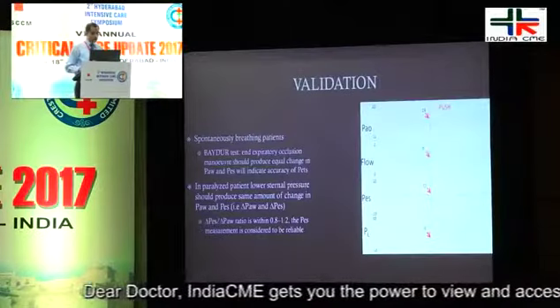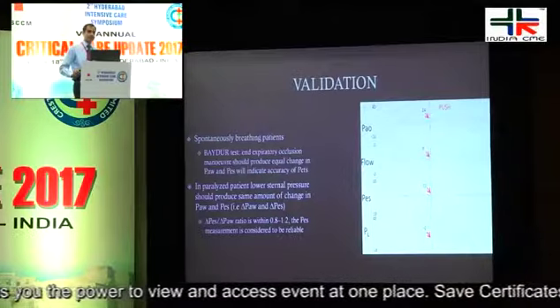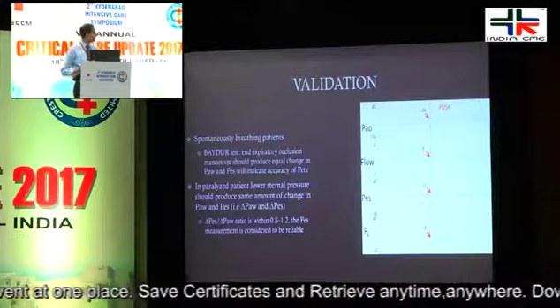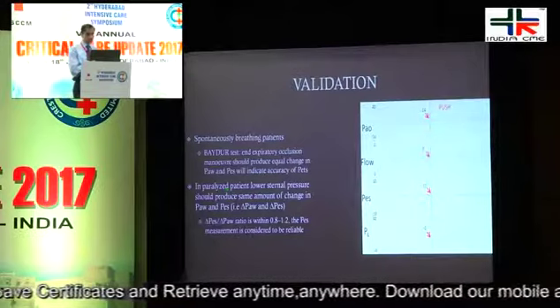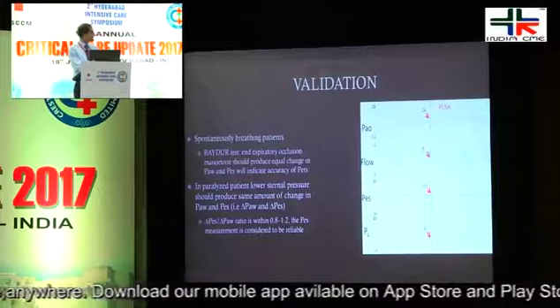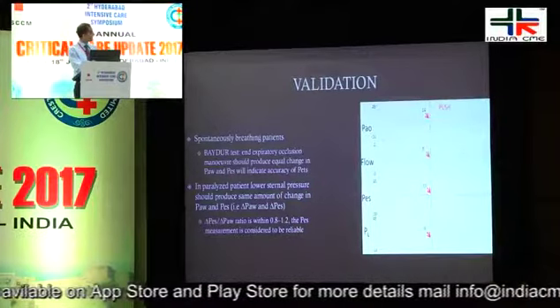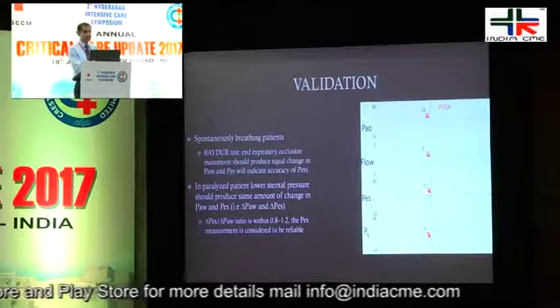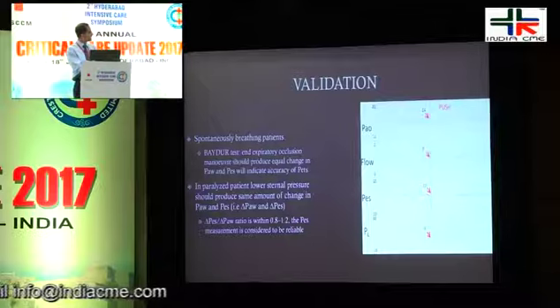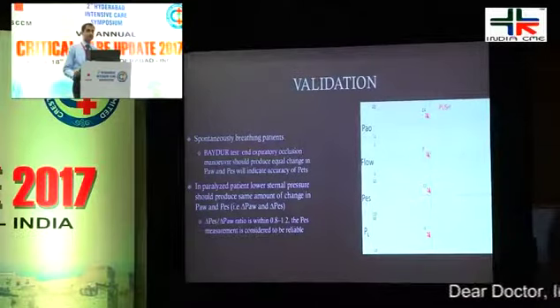Right. So, as I already told you, validation of the positioning of the tube, or the esophageal pressure system, is by what is called the Baydur test, which is nothing but you do the expiratory occlusion and you find that the deviation which happens in the airway pressure will be mimicked by the esophageal pressure. So if you get this kind of a graph when you have the end expiratory hold, then you know that you are probably optimally placed in terms of the esophageal pressure monitoring.